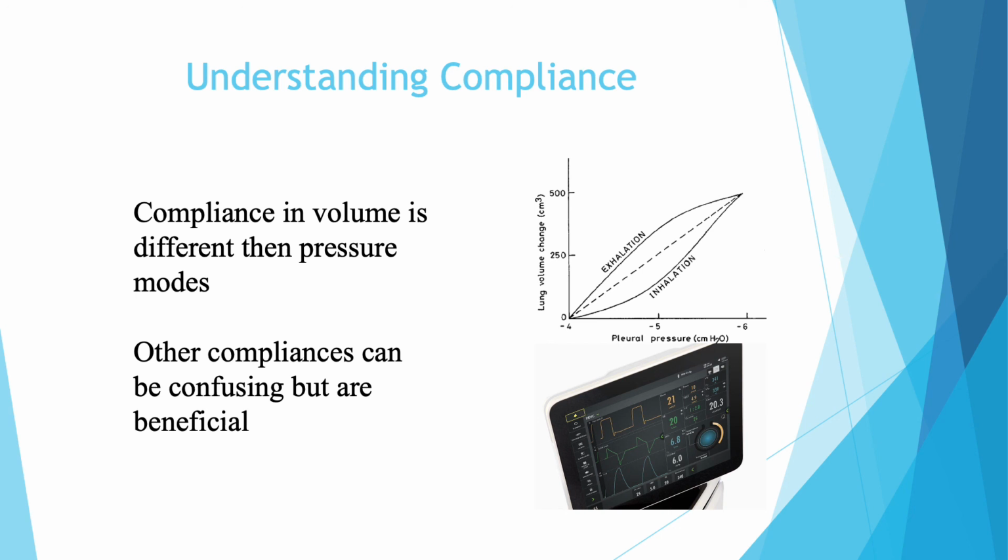So if you have a high peak inspiratory pressure and a low plateau pressure or alveolar pressure, usually about 5 below your peak inspiratory pressure, that means you have a problem in your large airways, which could be bronchoconstriction, mucus plugging, anything of that sort. It means a lot of airway resistance. If your peak inspiratory pressure and your plateau pressure run very similar pressures, this means you have a bad lung process. So you're at higher risk for ARDS or pulmonary fibrosis or anything like that.